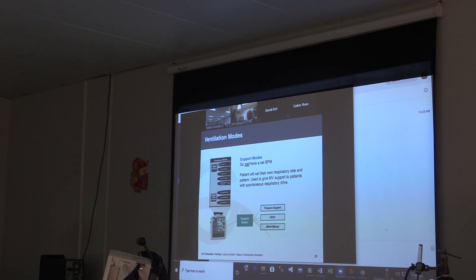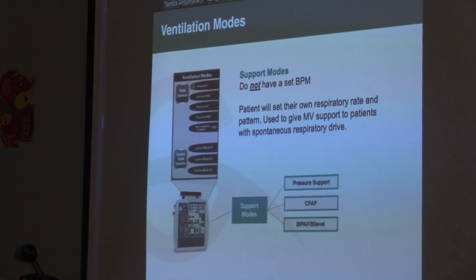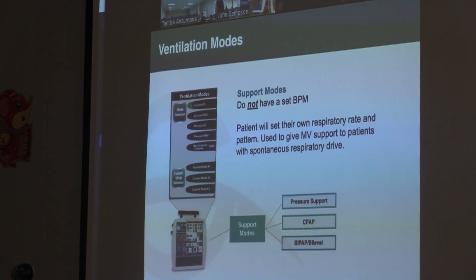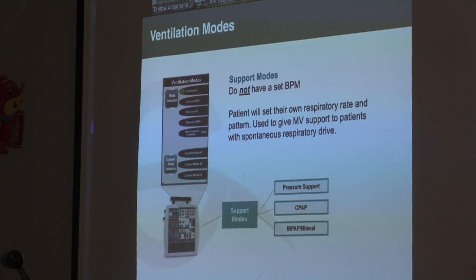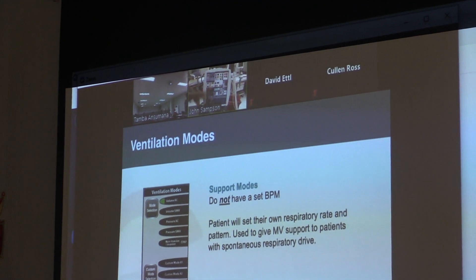I'm going to show you the machine. Can you see the machine now? I'm just going to show you what happens when I change this here. So now you see we went from assist control to just non-invasive.